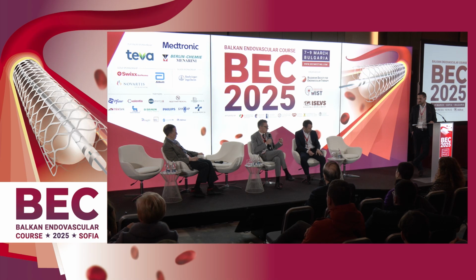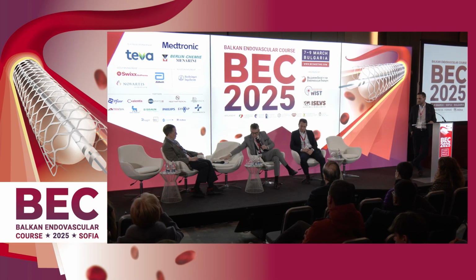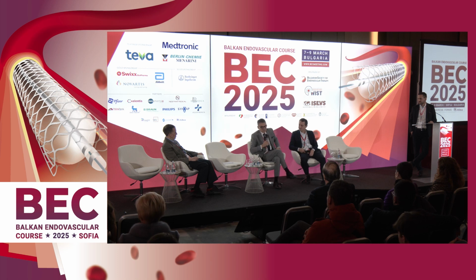Professor Nikolov mentioned the possible endoleaks by the gutters. To avoid gutters, it's quite important to calculate the proper oversizing. The rule for oversizing of the main body is to calculate half of the sum of all chimneys. So if we have, for example, 3 chimneys of 6 millimeters, it means 18 millimeters, half is 9. If we calculate the main body to be 30 millimeters, we have to add 9 more, 39. The problem is that a 39 graft doesn't exist. So there is a limitation.